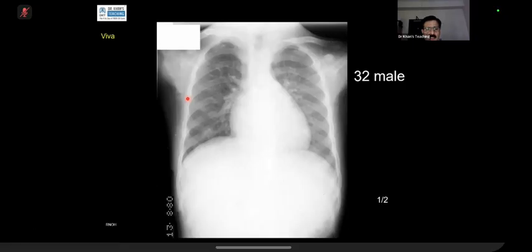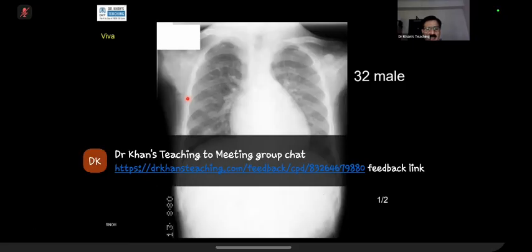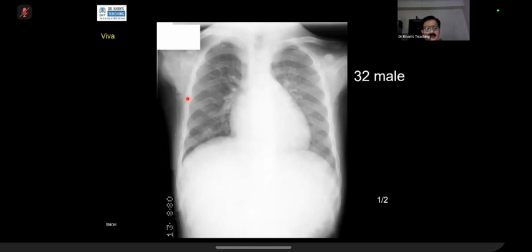it is because of osteoid, which is lacking calcium. And usually it is perpendicular or oblique to the cortex. Key point to remember is that you have to know the sites. Please remember the key concept that it has got nothing to do with weight-bearing bones. So the common sites include ribs. They will show you a case in the exam in which the osteomalacia looser zone will be on a chest X-ray, and once you pick it up, they will simply take down the film.